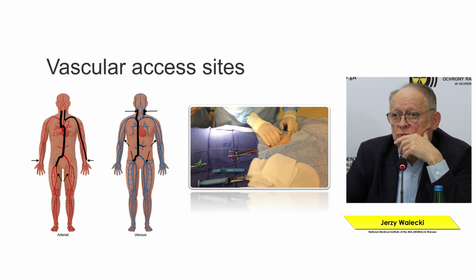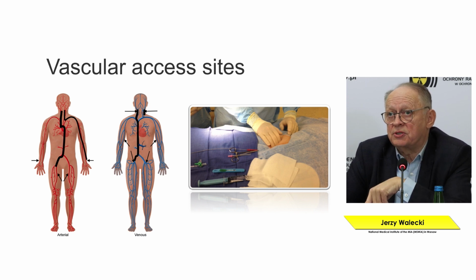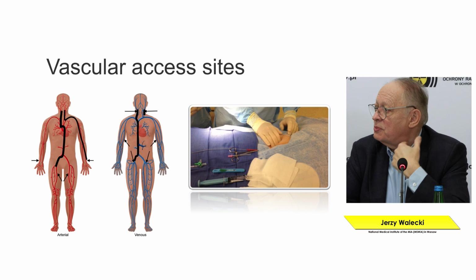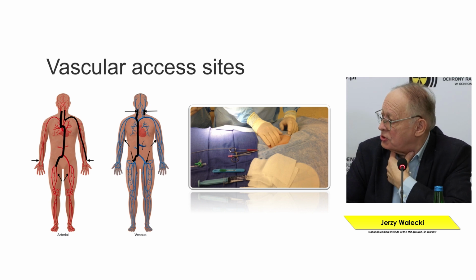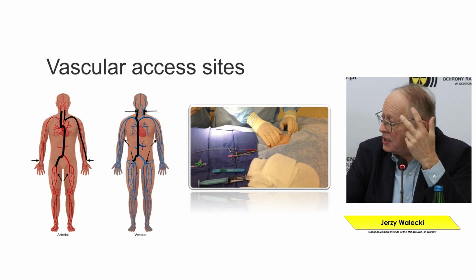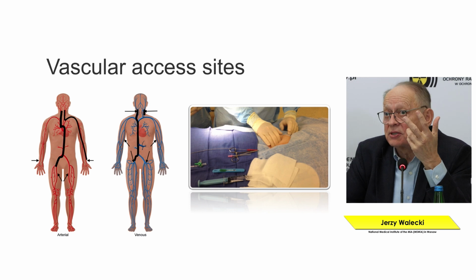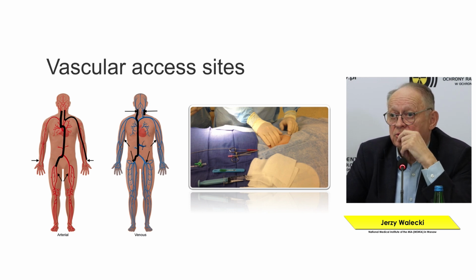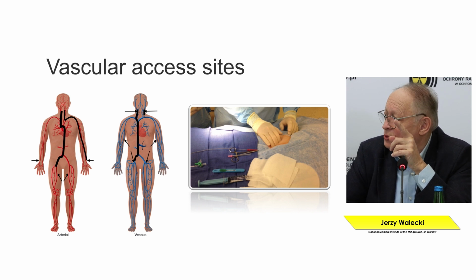And these are vascular access sites through femoral artery or carotid or radial. That's the arterial access on the left-hand side. Both are quite difficult.